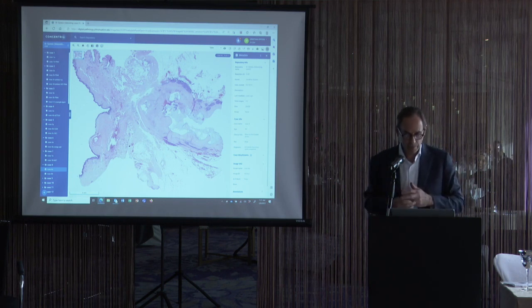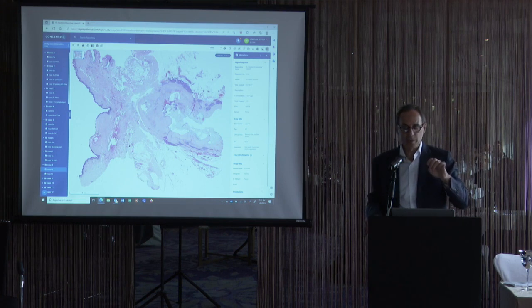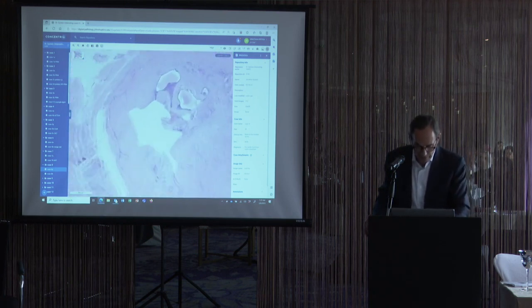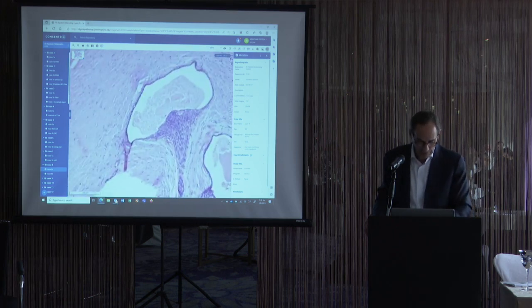Although the normal urachus is lined by urothelium, when we get neoplasms in the urachus, typically the urothelium undergoes glandular metaplasia. So most neoplasms in the urachus end up being glandular, either villous adenoma or adenocarcinomas of the urachus, less commonly urothelial cancer. Here's a urachus, for example, here's the little remnant of the normal urachus, lined by some urothelium. So that's normal urachus.